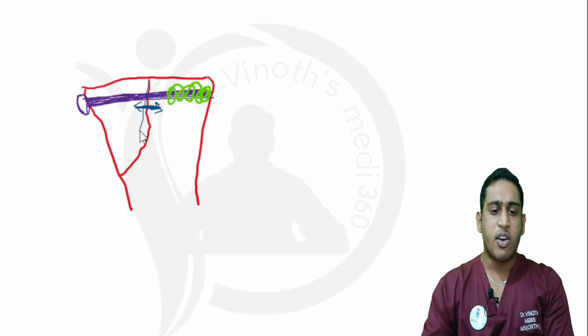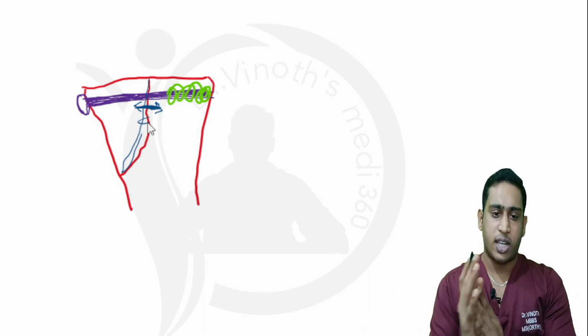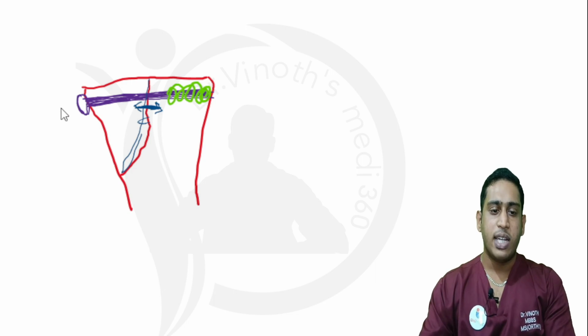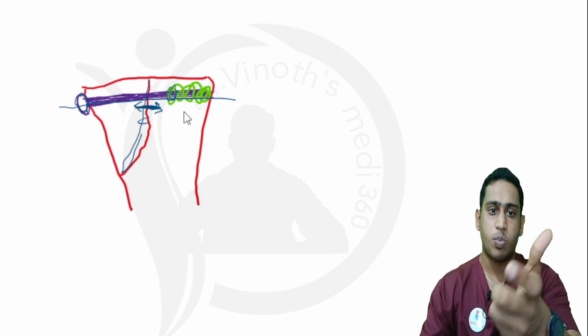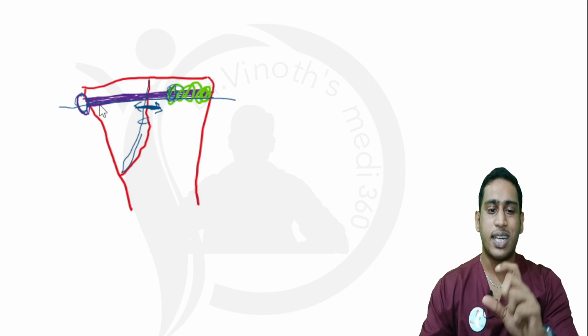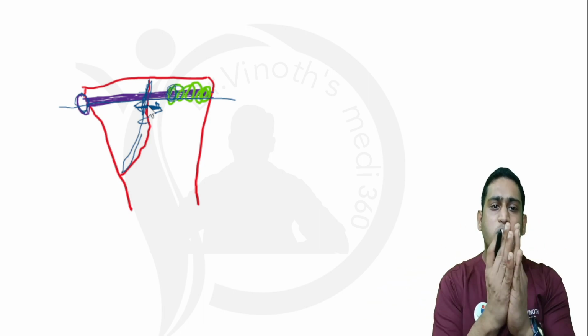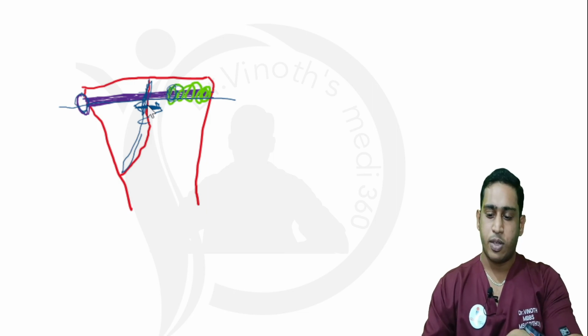Assume that this is a fracture of the lateral condyle of the tibia, and there is some displacement at the fracture site. I want compression at the fracture site, so what will I do? I will insert a guide wire first, then a partially threaded cannulated cancellous screw. Once the thread passes the distal fragment, the second fragment, it will have a good hold at the cancellous bone surface. After passing here, once I tighten the screw, this will provide compression, or reduce the displacement at the fracture site.